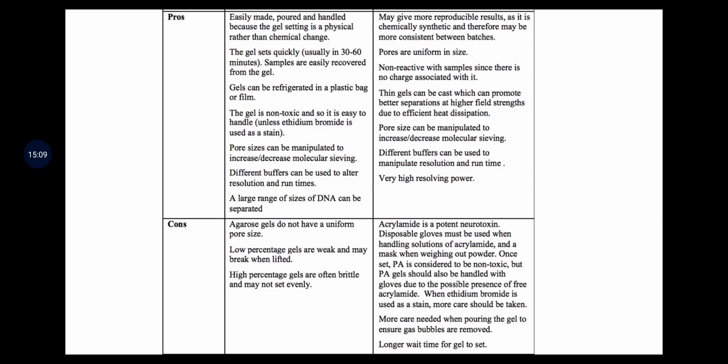The disadvantage of acrylamide is that it is a potent neurotoxin. Disposable gloves must be used when handling solutions of acrylamide, and a mask when weighing out powder. Once set, polyacrylamide is considered to be non-toxic, but polyacrylamide gel should also be handled with gloves due to the possible presence of free acrylamide.